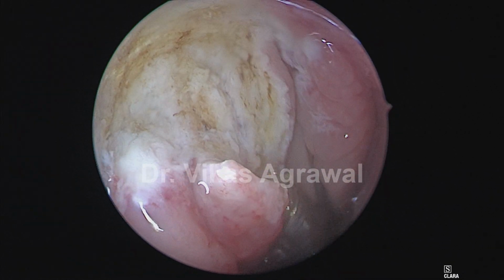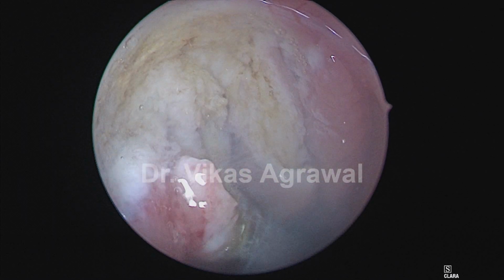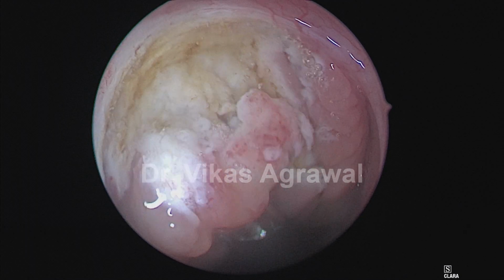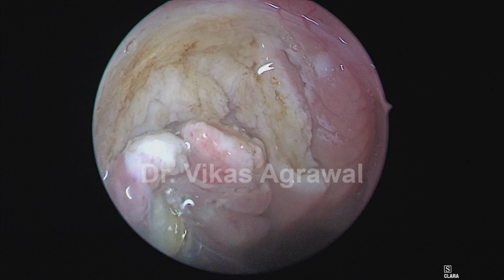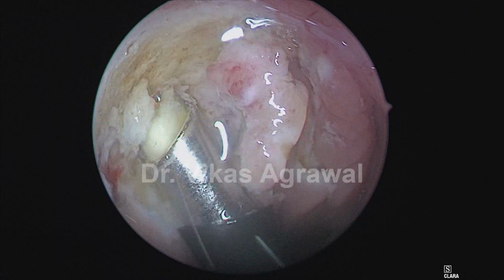No lymphoid tissues left over there. Now we'll debulk the adenoids so that we can get some space to move. That's the superior boundary.